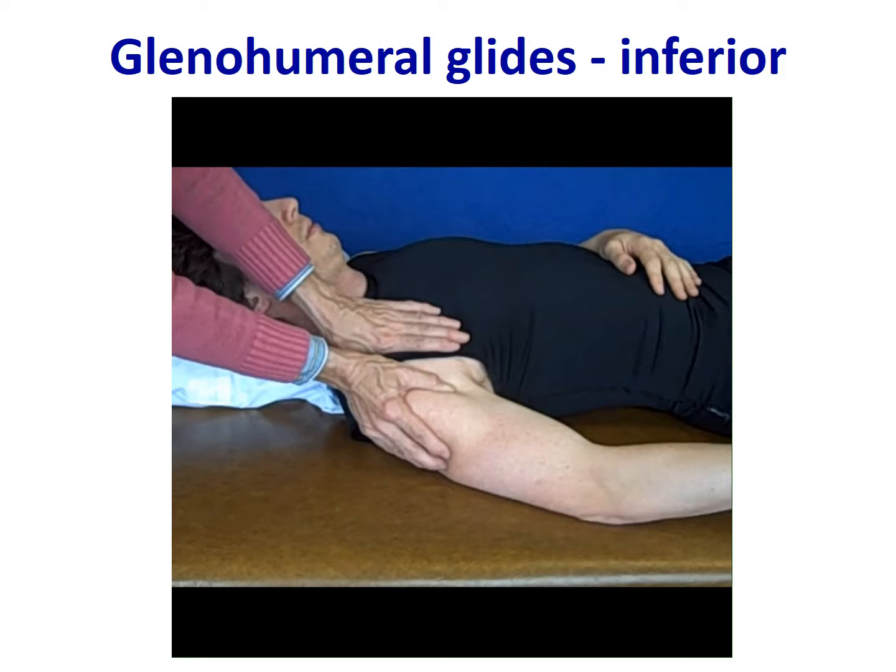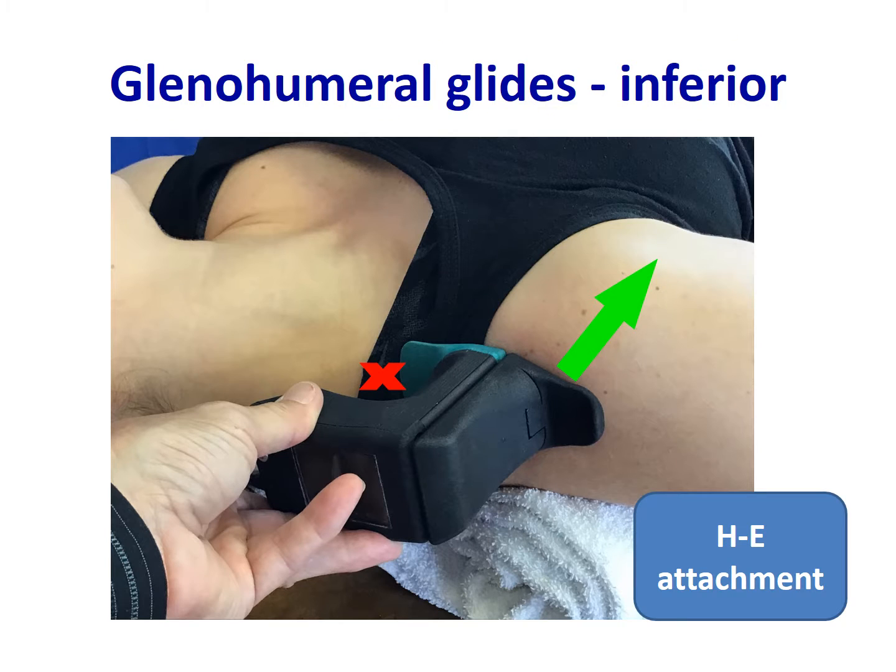Please note the alignment of the clinician's forearm with the direction of force desired. Here you see the Mobilator device positioned to perform an inferior glide of the glenohumeral joint using the HE, or green, attachment.